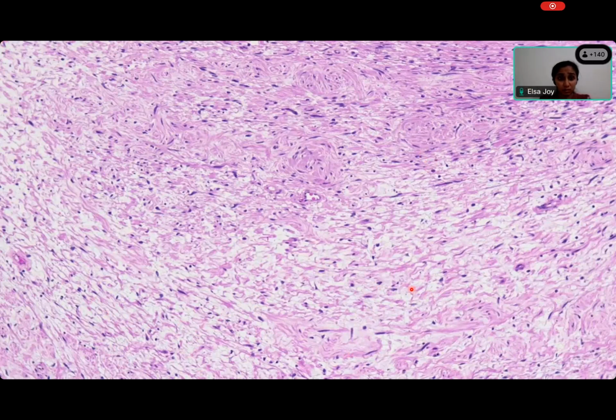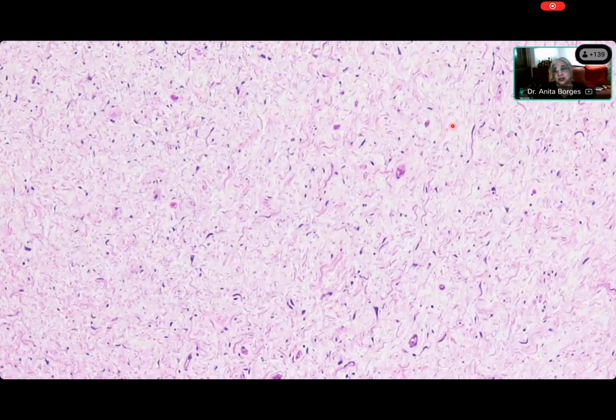Ma'am, buckling of cells. Ah, so the nuclei are buckled and the cells are also buckled. Now you can see that the cells are long. Look at the length of these cells, and the cytoplasm is wavy. You can see the nuclei are buckled. Look at that beautiful buckled nucleus over there. There are some of them where the nucleus is not spindly, sort of triangular, but by and large, all these nuclei are spindly.